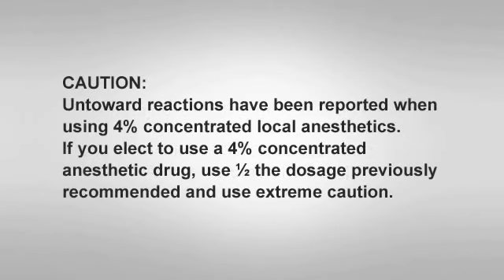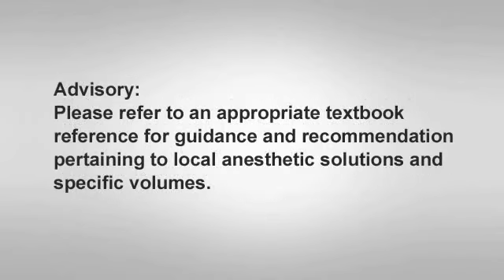If you elect to use a 4% concentrated local anesthetic drug, such as 4% articaine HCl, use 1/2 the dosage previously suggested, and use caution when using these medications. Please refer to an appropriate textbook reference source for guidance and recommendations pertaining to local anesthetic solutions and specific volumes.